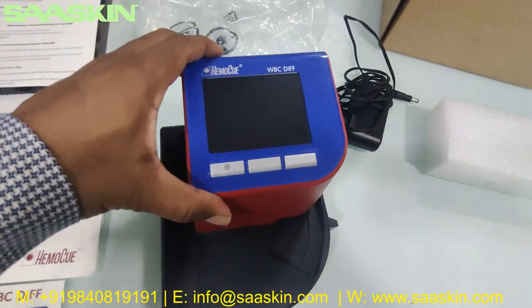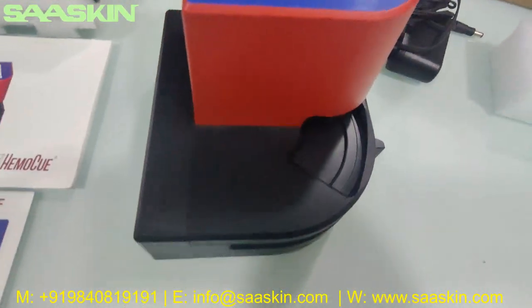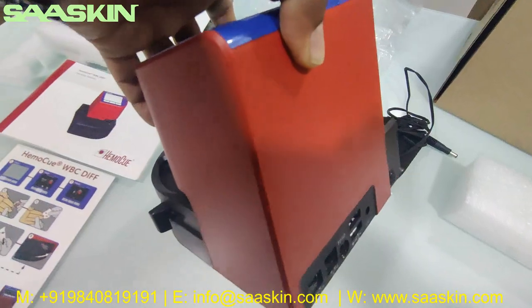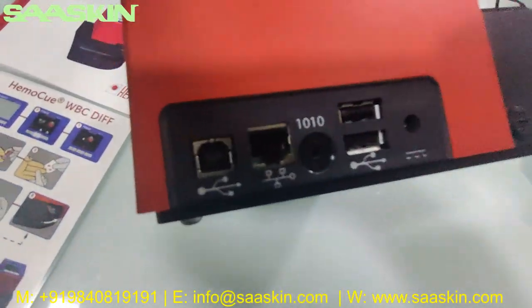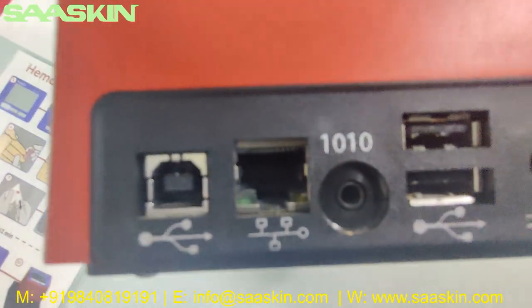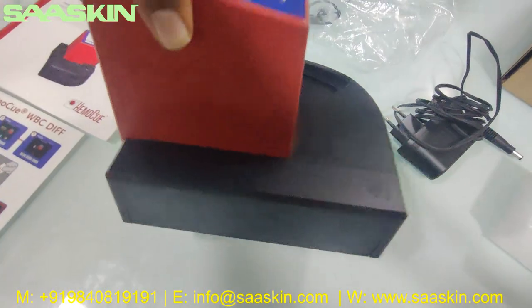Okay, you can see this is the machine. You can see it's HemoCue WBC differential, and this is how the machine looks. I'll show you around the machine. You can see the power adapter point, and also you have the USB port, and you have the cable point. So you have the other side, you can see here.